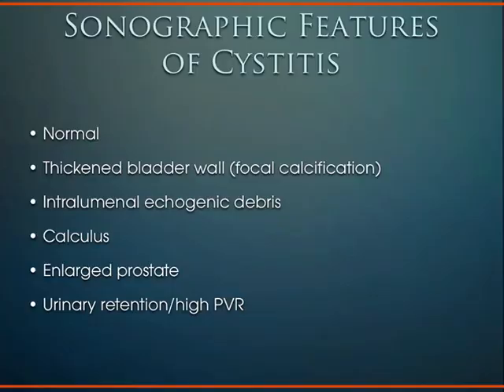You can also make a diagnosis of a bladder infection or confirm the diagnosis. Again, it's usually a very clinical diagnosis, but sometimes the patient can't talk to you, or they're too young, or they're intubated, and you're wondering why they have a fever. As you're doing your fever survey with ultrasound, you can come down to the bladder and you'll see a thickened bladder wall.